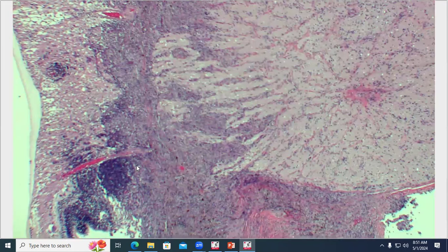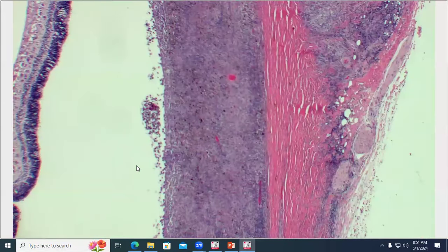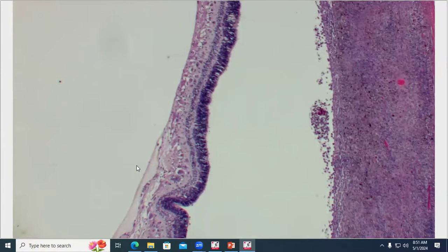So the main thing about this disease is how uveocentric the inflammation is. Where there's pigment, there's inflammation. If you don't have pigment, you don't see inflammation. For example, there's retinal detachment, as we have seen on the gross examination. How do we know? There are lots of cells free floating in the subretinal space.